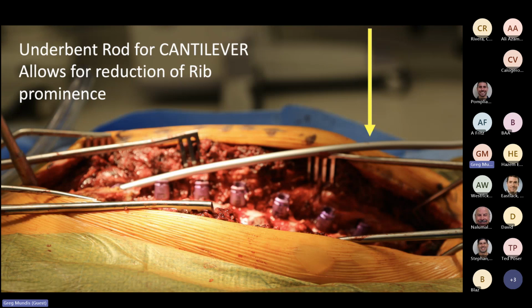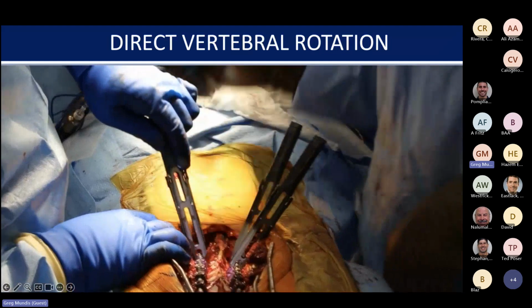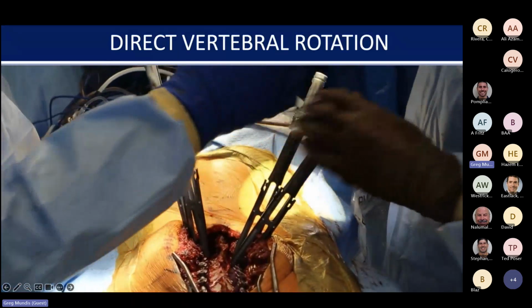When you push that rod down on the right side, you'll see that it's exerting its force higher up, and then you basically just cantilever and reduce that down. So the next step, if you want to do this, is a direct vertebral rotation.